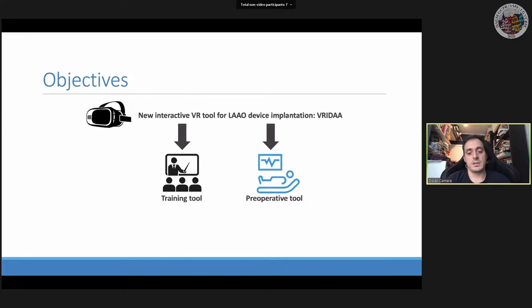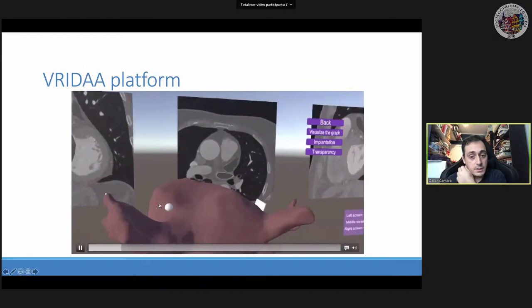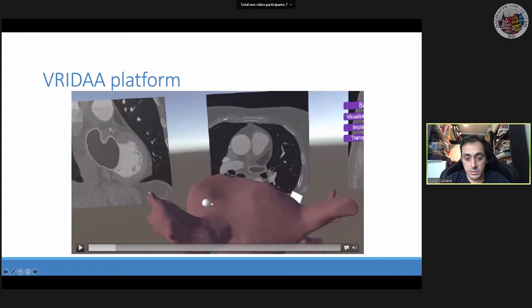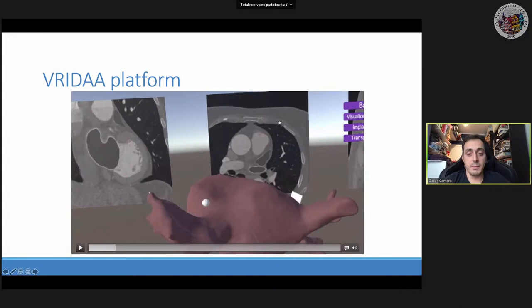A short video of the current platform setup: the user can see the 3D geometry together with important landmarks for the intervention and the centreline, which helps decide which device to implant. Medical image slices and the segmented left atrial appendix are shown in the background for clinicians used to that type of visualisation. There are menus and graphs showing diameter evolution along the geometry — important information for device selection.